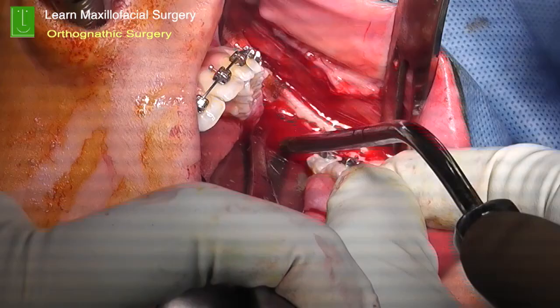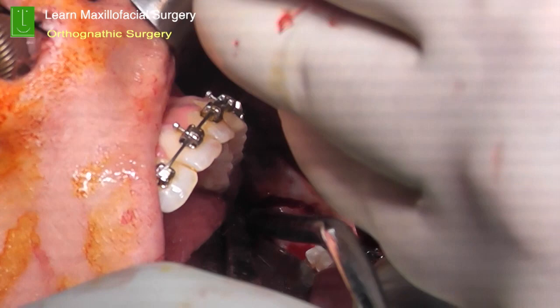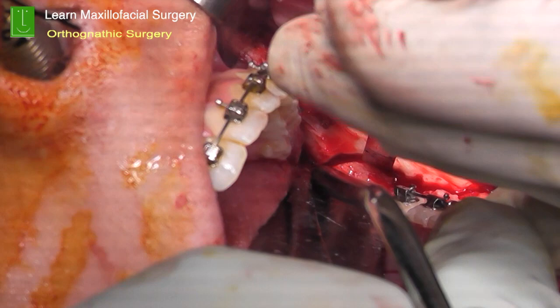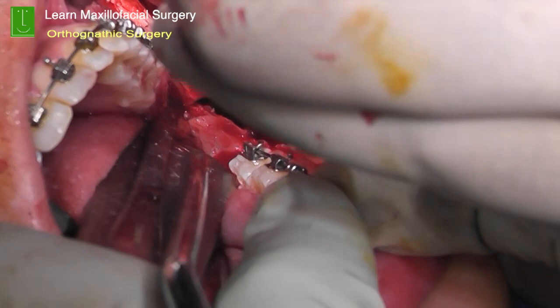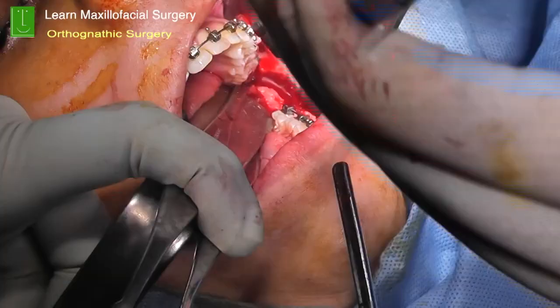This is where you're using an osteotome now. Again, be very gentle in the tapping and go all the length of the cuts which you have done with the osteotomy. Just gently run it along the entire length, a vertical cut. That's good. That's the springing which you can see which happens there. Very, very small amount of pressure which you need to do, and now we are engaging the buccal cut.